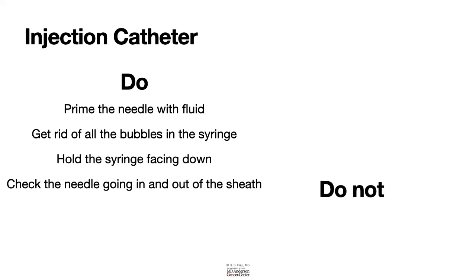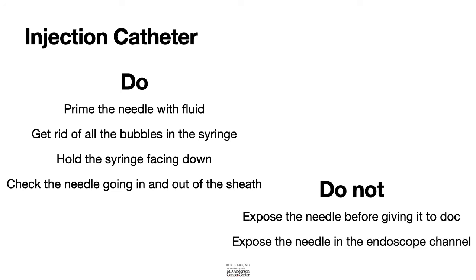I want to repeat here, there are certain no's that I do not want you to do. Do not expose the needle before giving it to the doc or to anybody. You will cause injury. And do not expose the needle in the endoscope channel. You will damage the channel. Channel damage can cost anywhere from a few thousand dollars in repairs.